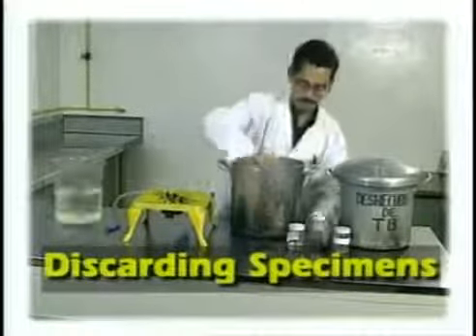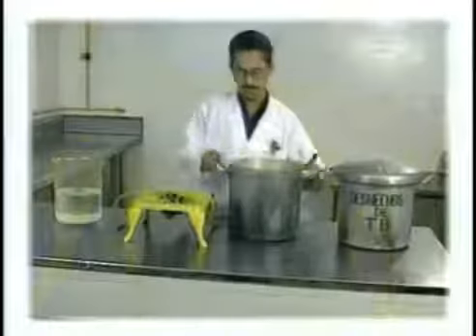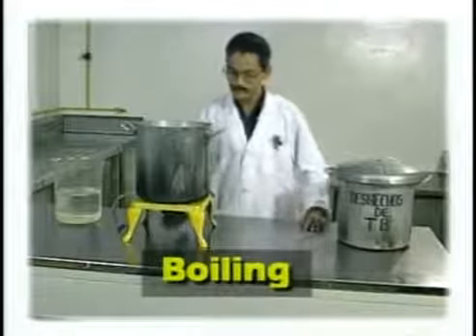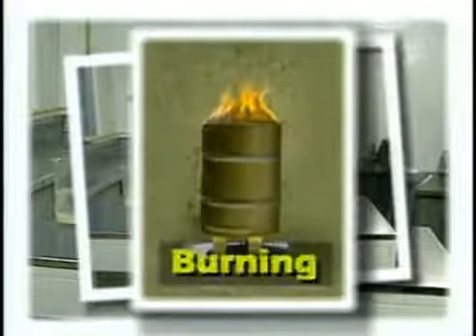Handle specimens carefully. All sputum specimens are considered potentially infectious. Save all specimens until the smears have been examined and recorded. Then sterilize and discard them. Disposable containers must be used only once.